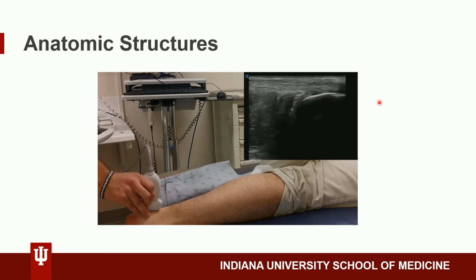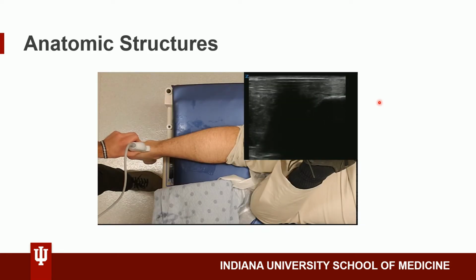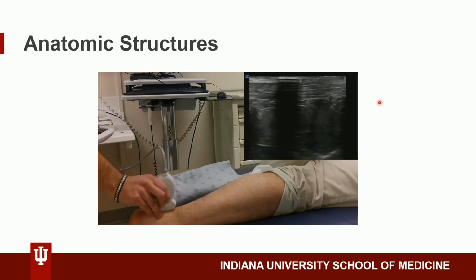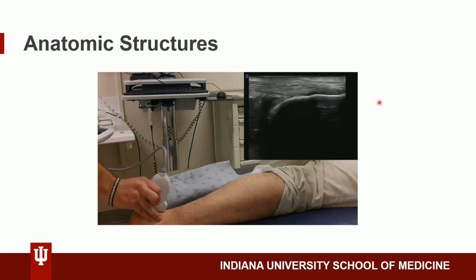As was previously mentioned, we can see the concept of anisotropy when my probe slightly moves from the tendon tract. However, we correct this by realigning our probe and in a side-to-side sweeping fashion confirmed that there is no pathology of this tendon.